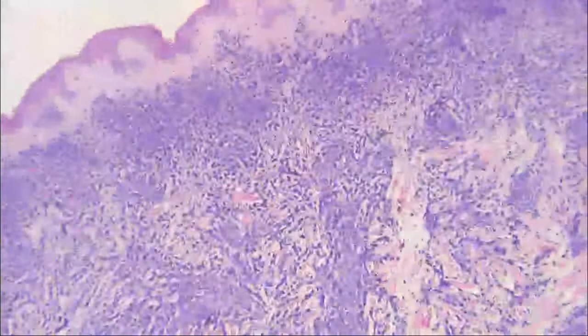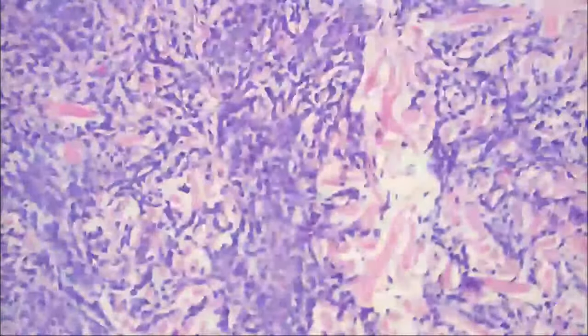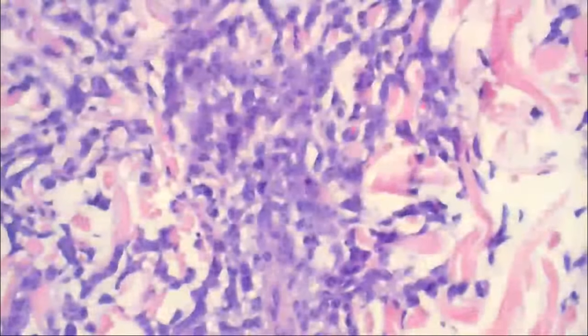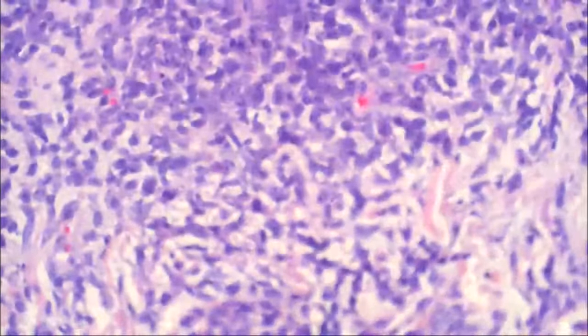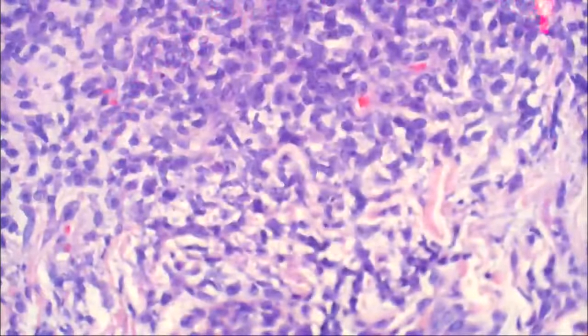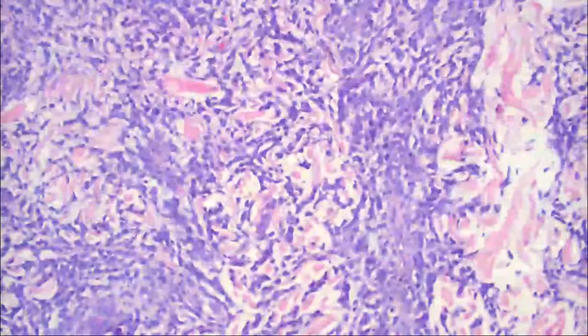And then as we go to further magnification, these don't look like classic normal lymphocytes, do they? No. They're way too big. They've got way too much cytoplasm. And they've got some cells that are in mitosis right there. So what's the diagnosis? Like a lymphoma or leukemia. Good. And which of those two do you favor?